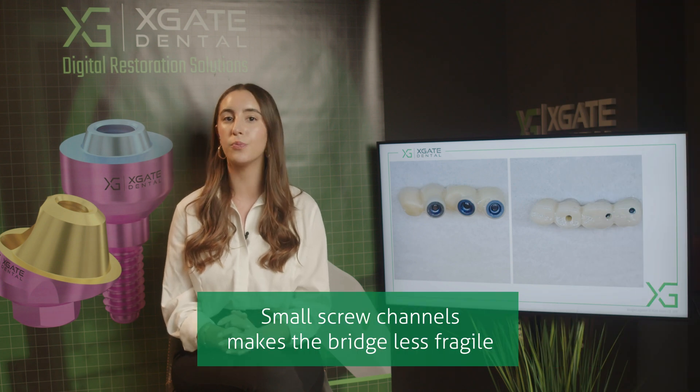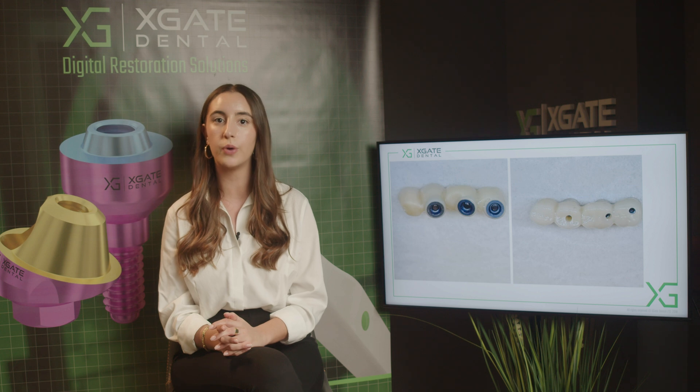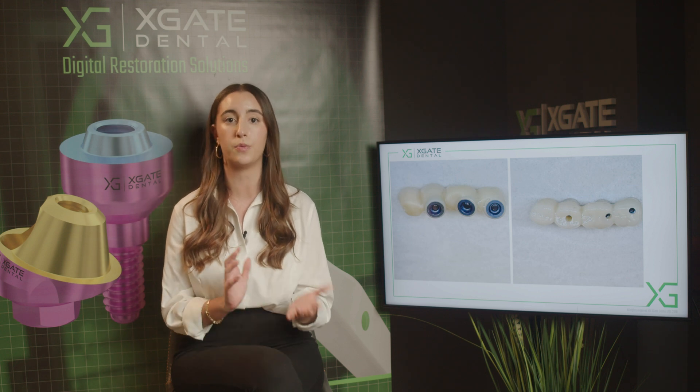There is less of a chance that the crown will break because you have a cantilever. When the patient chews on this crown, the fracture point would be around the screw channel. So if you have a large screw channel, you have more chances that the teeth would break.